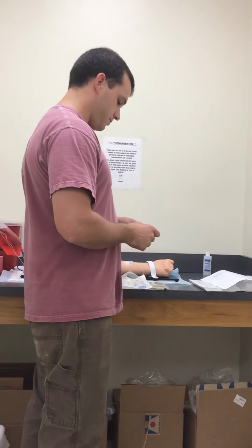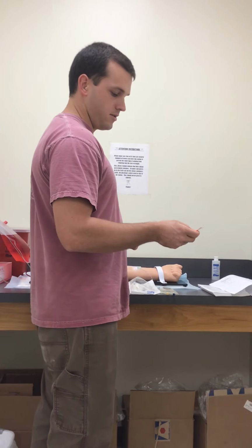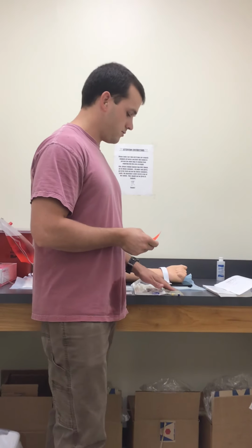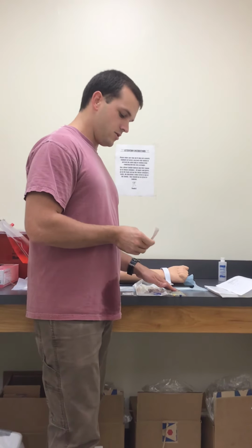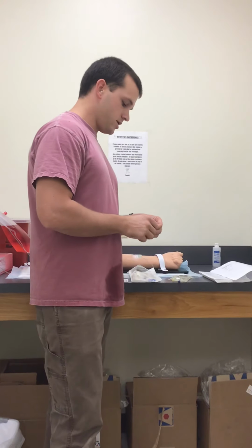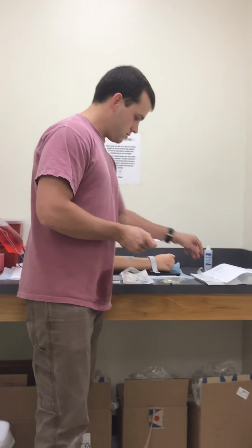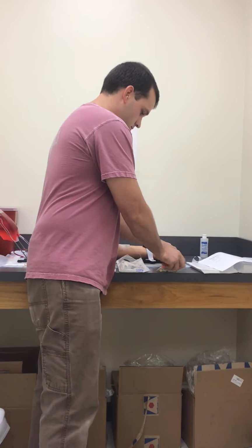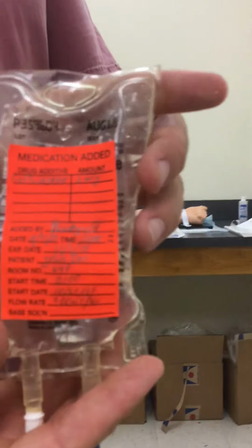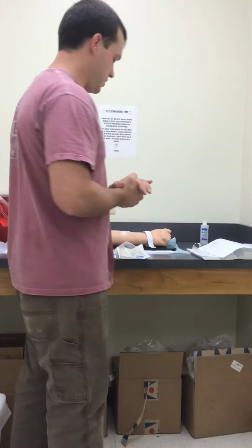I'm going to fill out my label with the drug, the amount of the drug in it, today's date, the expiration date on the drug I have here, the patient's name, room number, start time, and my initials. I'm going to take that label, which I have already filled out, and apply it to the drug. You can see that I have filled out all the information needed. I've got everything that I need to enter the patient's room.